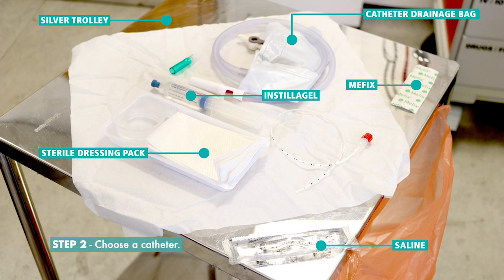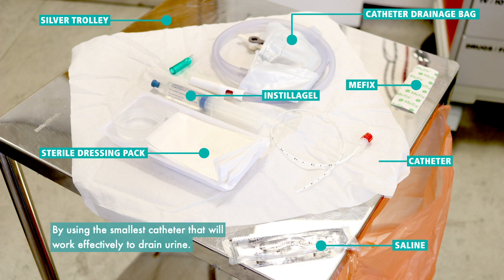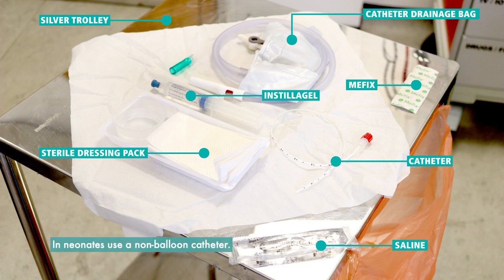Step 2: Choose a catheter, using the smallest catheter that will work effectively to drain urine. In neonates, use a non-balloon catheter, and use a catheterization guideline to size according to age and weight.